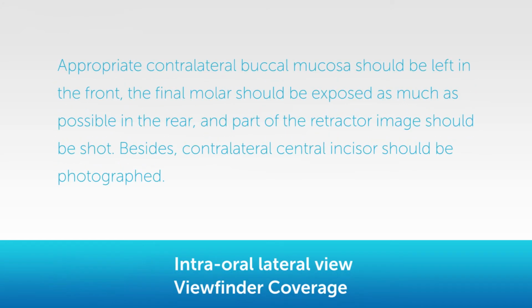Intra-oral lateral view, viewfinder coverage. Appropriate contralateral buccal mucosa should be left in the front. The final molar should be exposed as much as possible in the rear, and part of the retractor image should be shot. Besides, contralateral central incisor should be photographed.